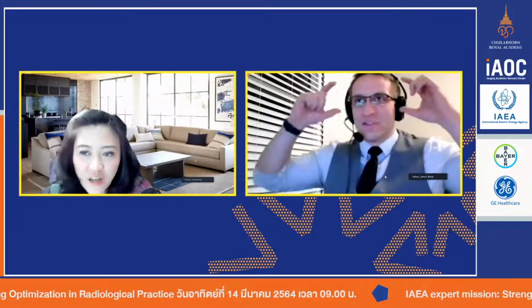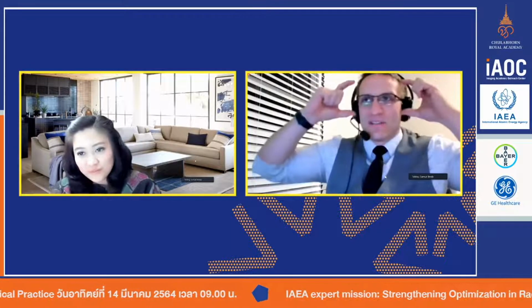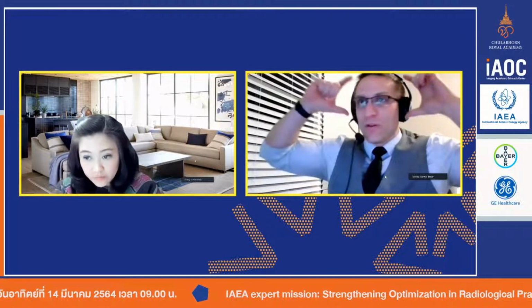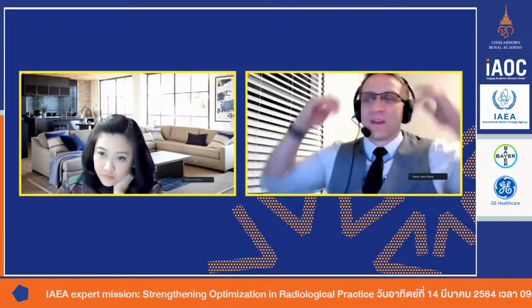So obviously the fastest you can go is with a wide beam width, 16 centimeters, 160 millimeters. That will cover the cranium for all kids and most adults, and you can't go faster than that.